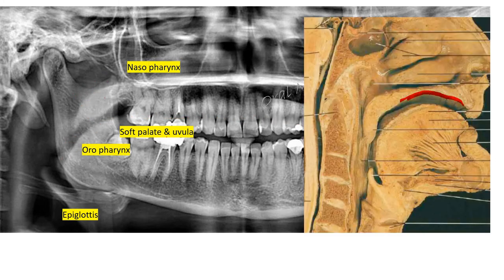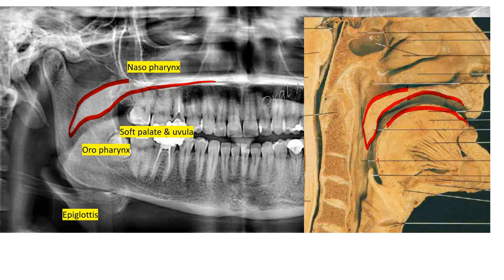This is the hard palate. This is the soft palate that extends as the uvula, so the hard palate then comes down into the soft palate. This is the uvula. Here is the dorsal surface of the tongue. The space between the soft palate and the nose is the nasopharynx, and the space between the tongue and the soft palate is the oropharynx.